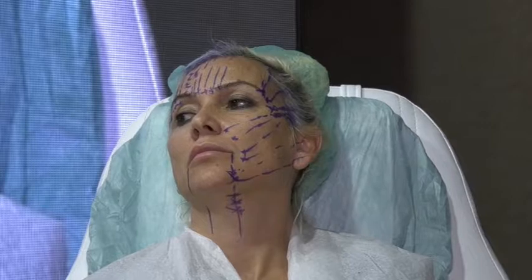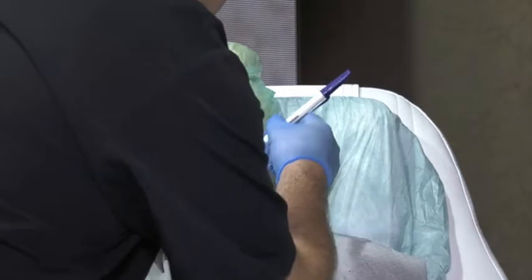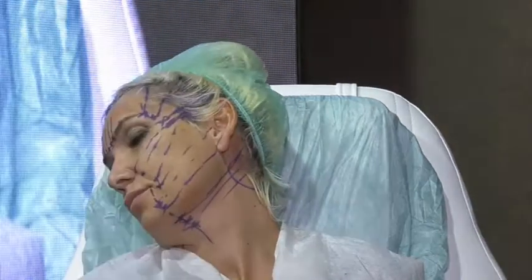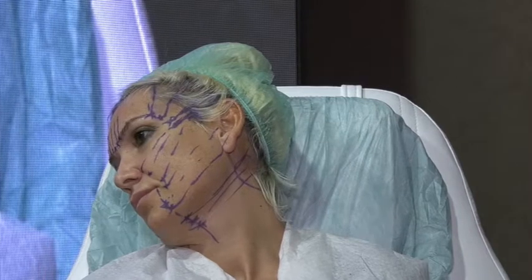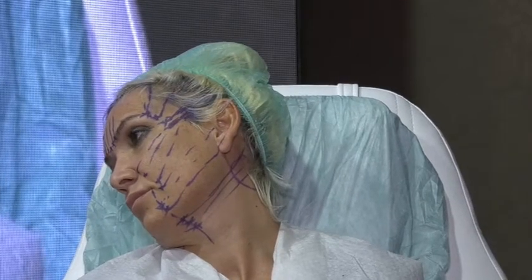We go without the crisscross, and we try to go the maximum we can, to fix near the mastoid, in the mastoid fascia. That means I have to cross the sternocleidomastoid. If you don't cross the sternocleidomastoid, you will have a result of less than 40%. You will never have a good result. We have to go further, so we do a real lifting and a real fixation.